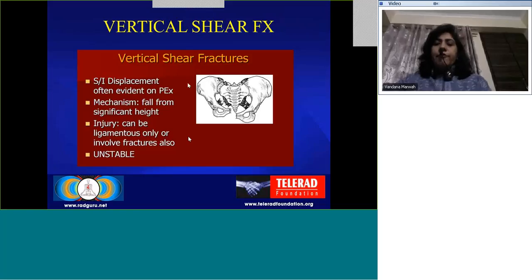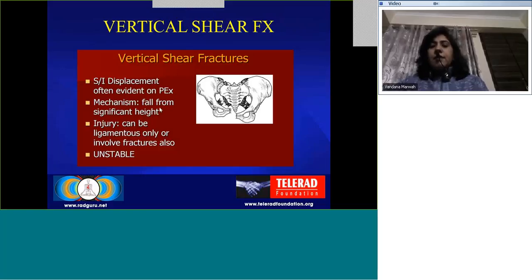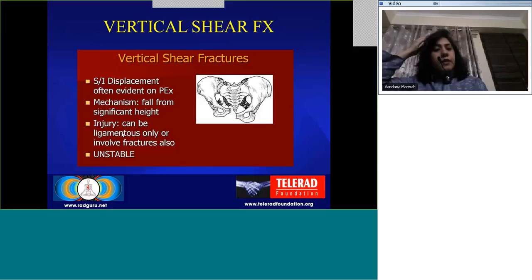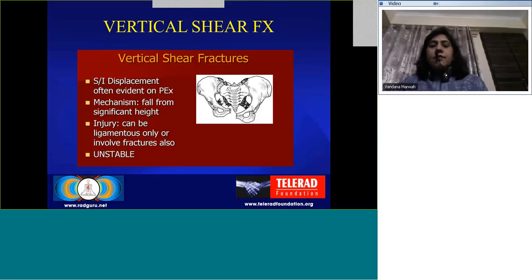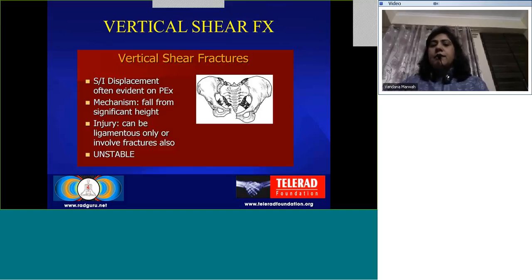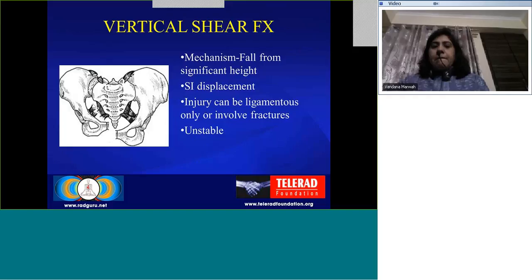Coming to vertical shear fractures: there will be sacroiliac displacement even visible on X-rays. The mechanism is a fall from significant height. It can be only a ligamentous injury but may involve fractures as well. These injuries are always unstable — all ligaments including the iliolumbar and sacrotuberous ligaments are torn. There is a vertical offset; the pubic symphysis is widened and displaced superiorly, and the sacroiliac joint has all ligaments torn with a vertical offset. The key finding to pick up on vertical shear injuries is the sacroiliac joint displacement — these are always unstable.